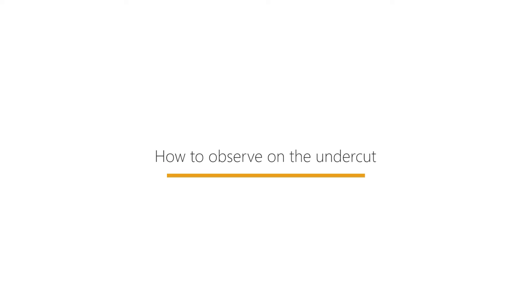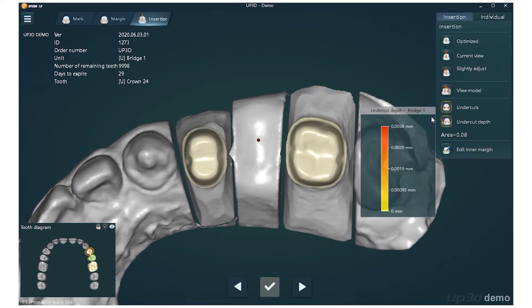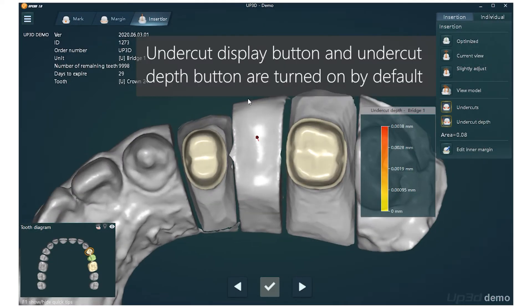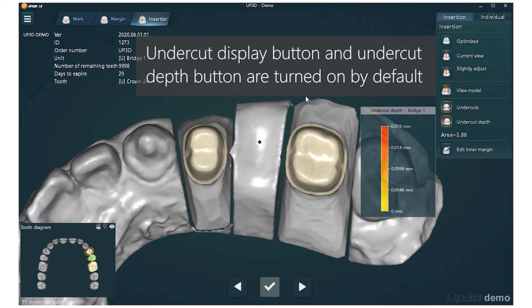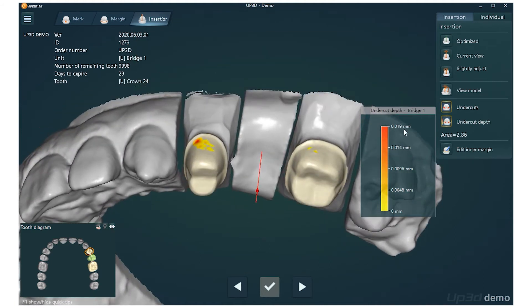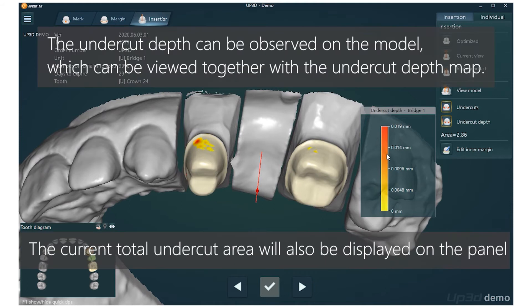How to observe the undercut? The Undercut Display button and Undercut Depth button are turned on by default. The undercut depth can be observed on the model and viewed together with the undercut depth map. The current total undercut area will also be displayed on the panel.